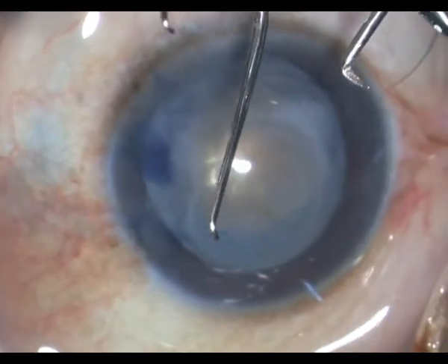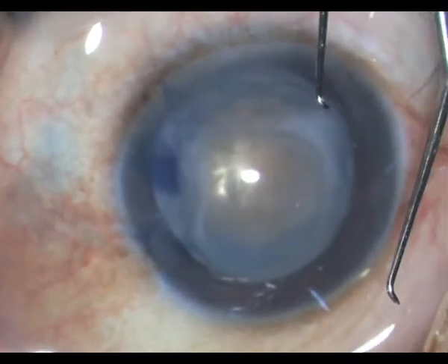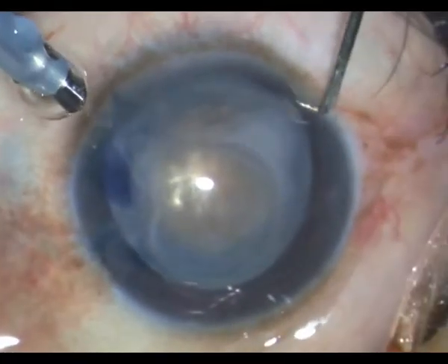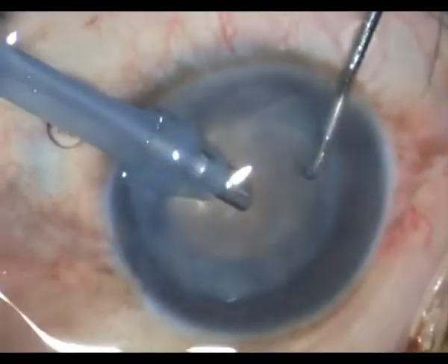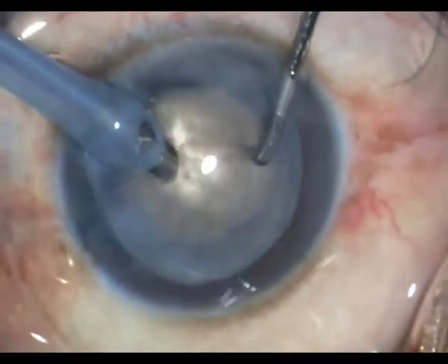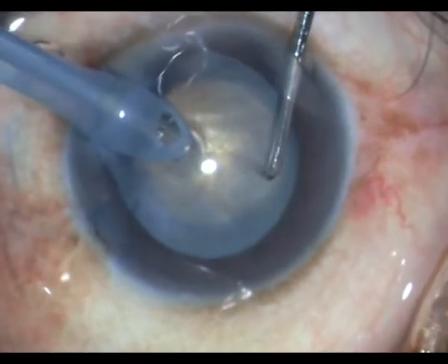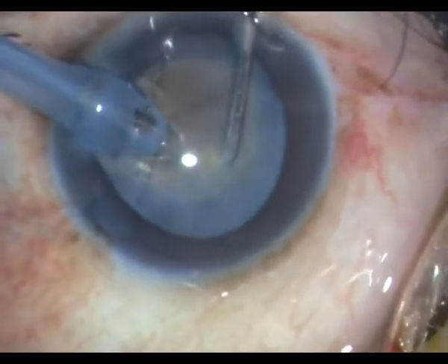And look at the arsenal of sharp choppers I have on hand. I look at all of them and then choose the best. This is almost a 2 mm very sharp stout chopper.